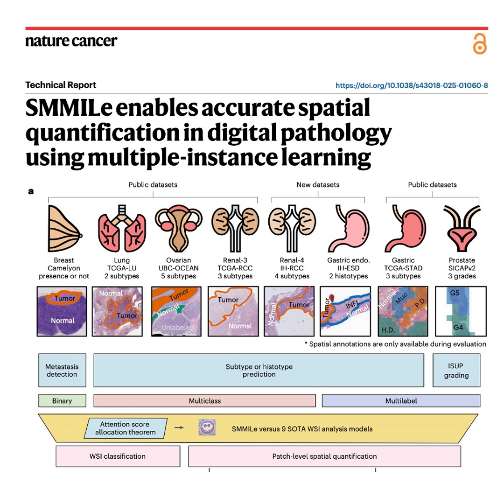Oh, yes. In those specific datasets, the actual tumor regions are incredibly tiny compared to the whole slide. Mathematically, the penalty for a misdetection is lower there. So a competing method scored competitively on overall prediction. But even then, SMMILe still beat it by over 23% in that spatial F1 score. It always draws the better map.